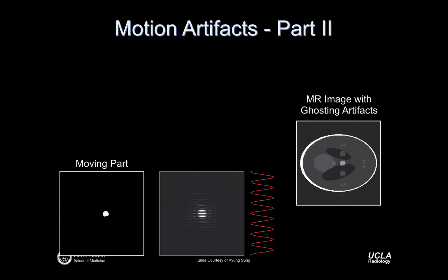So we said this is a phase encoding artifact. It has a relationship to the direction in which I'm doing my phase encoding. If I start phase encoding left-right in this direction, then this flow artifact will swap to this direction. That may or may not be better for the purposes of the artifact. Usually we care about artifacts because they interfere with measuring something or seeing something that we really care about. Sometimes it's good enough to just shift the artifact.